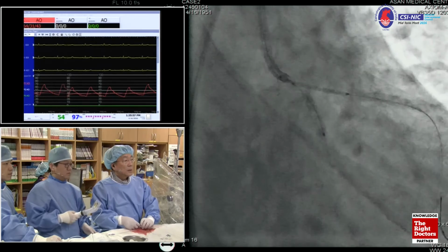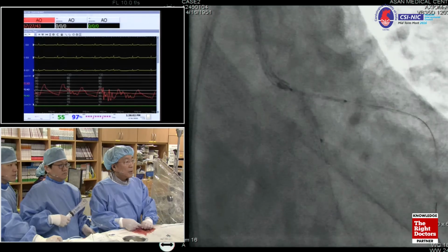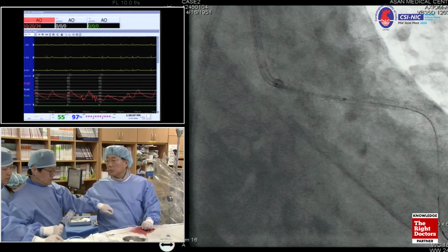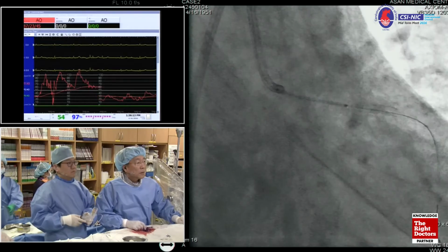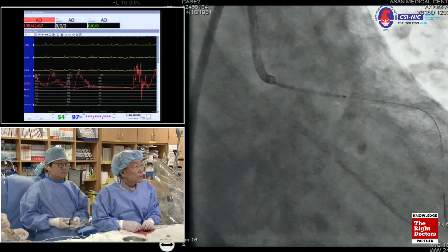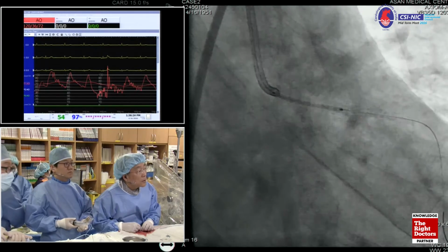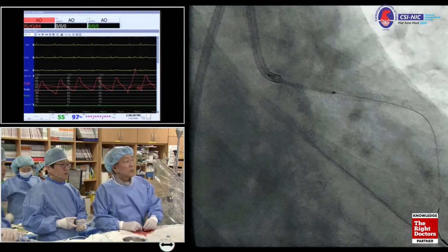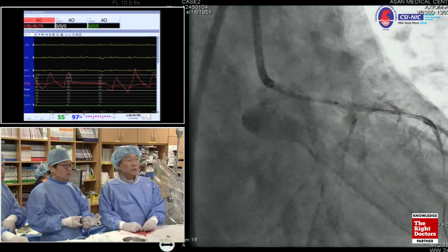All right. So why not? The reason why it is quite easy to perform after the stent deployment, we want to pull out, hold the system, right? It's quite easy. Everybody can do that. Test, please. So another main stent from the LAD, overlapping stent from the first one, and I pull the stent 1 millimeter further. All right. It's okay? Yes, okay. All right, so in order to cover the ostial part of the main, test, please. What do you think? Okay.